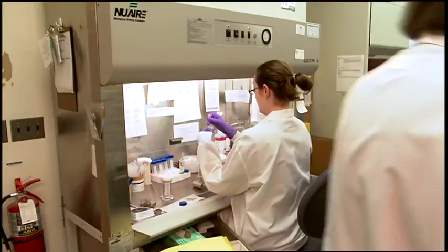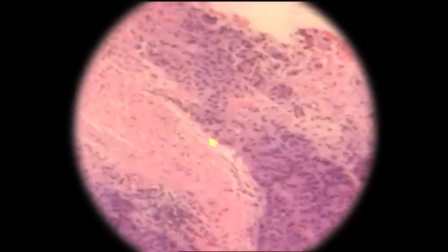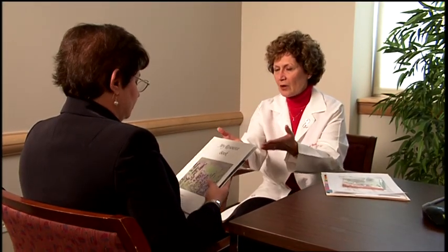The breast samples are sent to a pathology lab where they are carefully examined. Results are reviewed by the radiologist and then made available to the patient and doctor. Based on the findings, the doctor makes recommendations for surgery or other beneficial treatments.